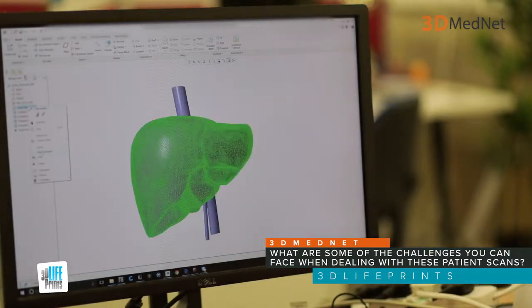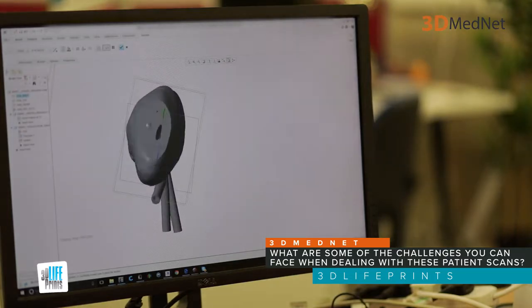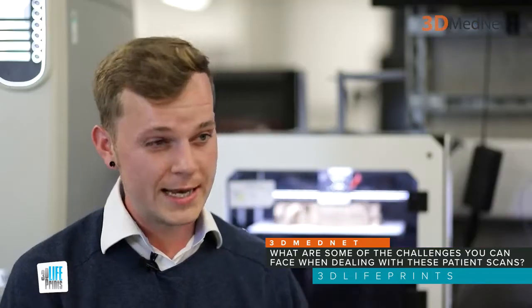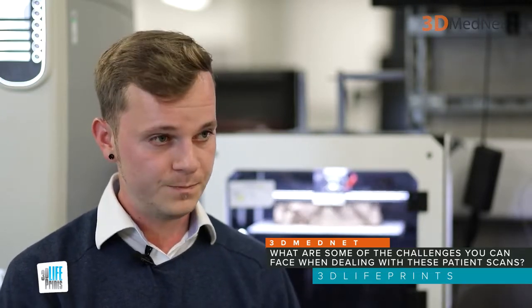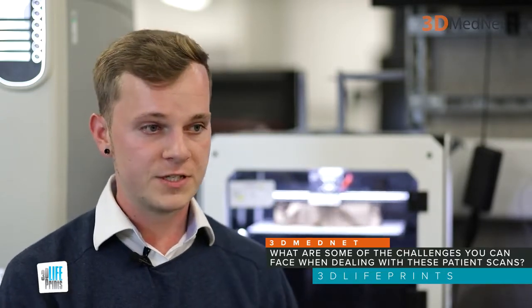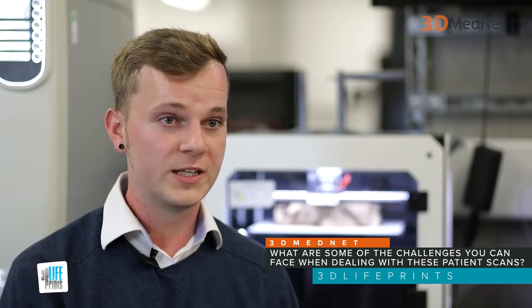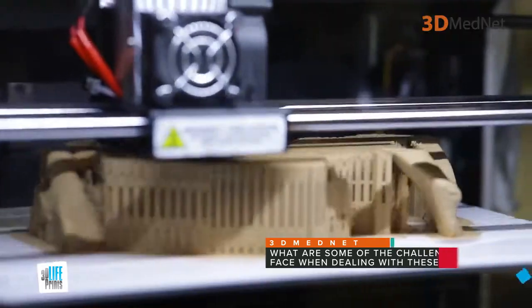Some alternate challenges there would be metalwork or devices that have been surgically put inside the patient previously. These can sometimes interfere with the scanning and cause artifacts throughout your CT or MR scan, which then gets translated onto the modeling and onto the 3D model itself. So steps can be taken to reduce that from the scanning perspective, but it often just ends up being a lot of manual time removing this artifact and working through these specific areas that the surgeons and the hospitals need to see.